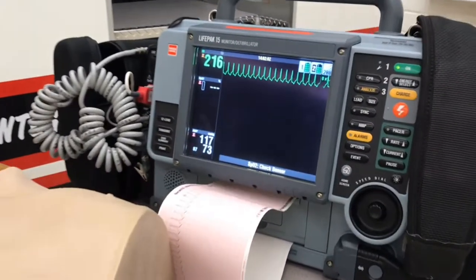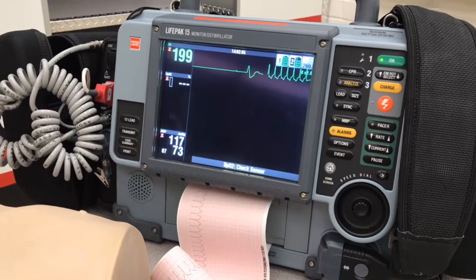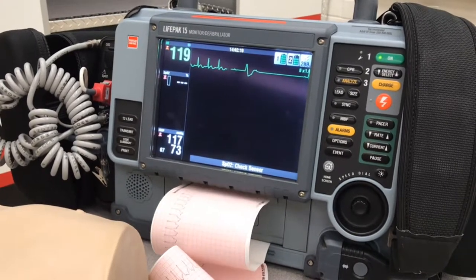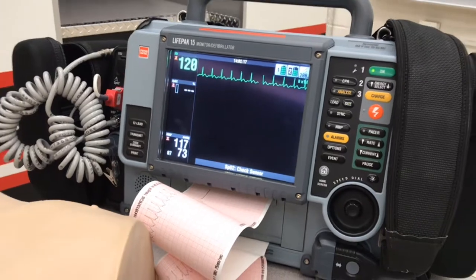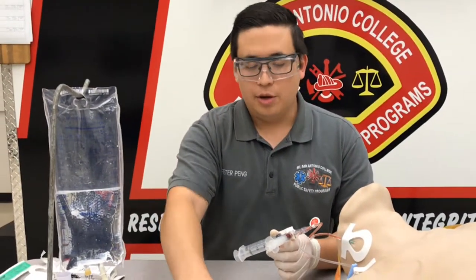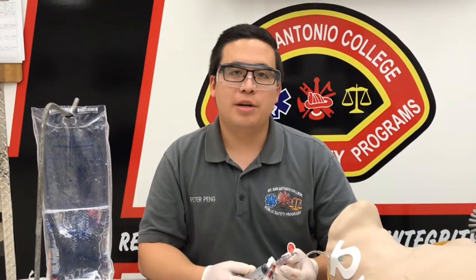Now we'll look back at the monitor. You may see some asystole, you may see some ectopy, and eventually hopefully it'll go back to a regular sinus rhythm or sinus tach. We can stop printing at this point. Now just make sure that you flow your IV fluids — you might want to think about doing a fluid bolus — and you want to reassess vital signs and reassess the patient's condition.